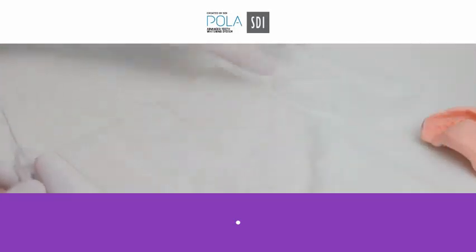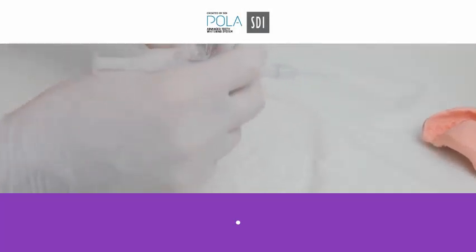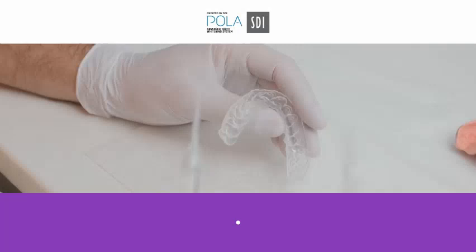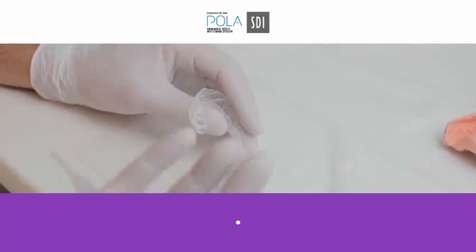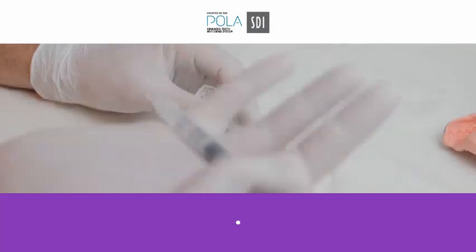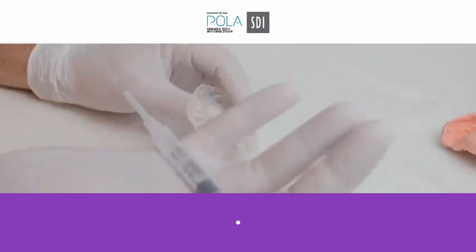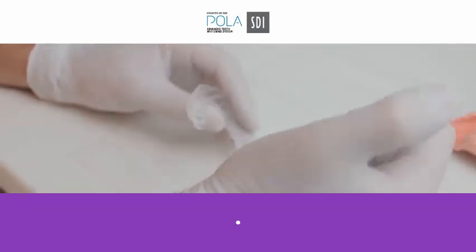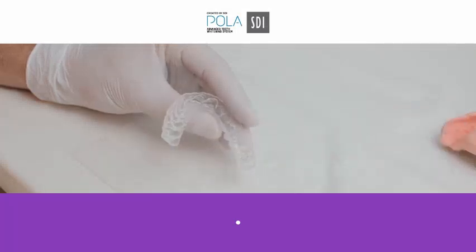So this is another tray which we made earlier. This is actually for a different patient. The key thing with a whitening tray is always that sigh when a patient comes through the door and they've run out of whitening gel. They've used it all and there was no reason, and they're saying, you're not giving me enough whitening gel. All they've done realistically is press the plunger and fill the whole tray with whitening gel, which is an absolute waste of time.